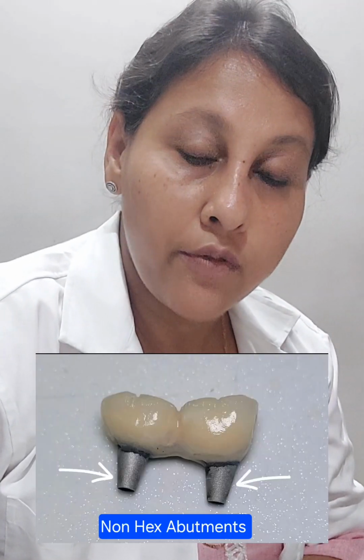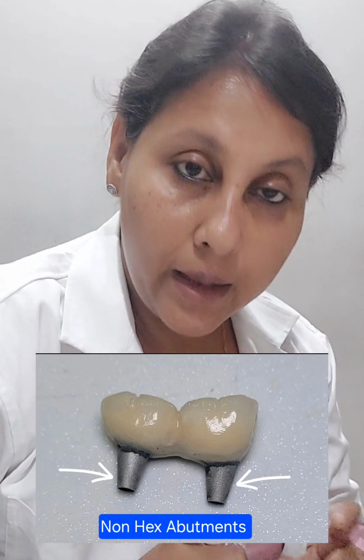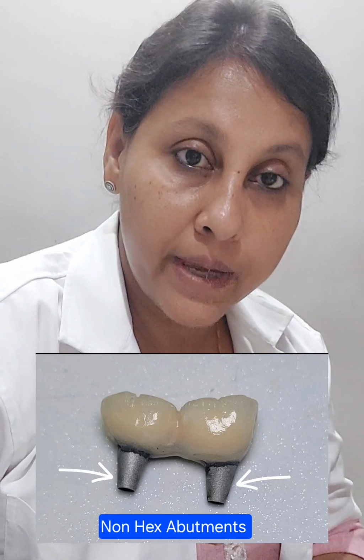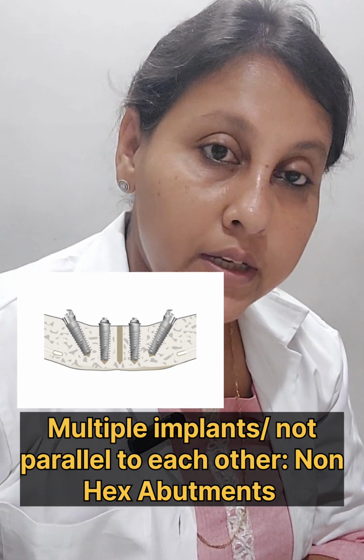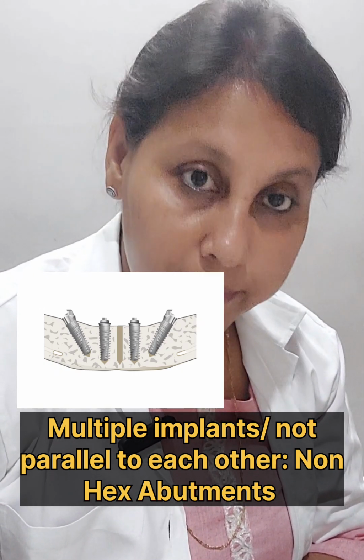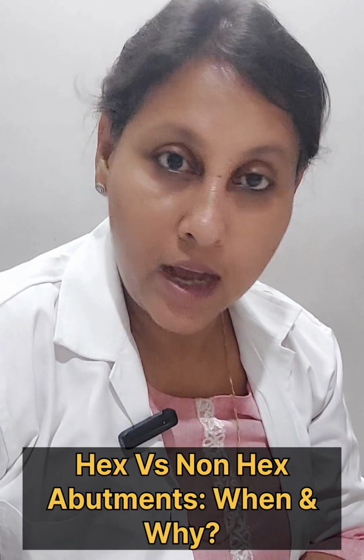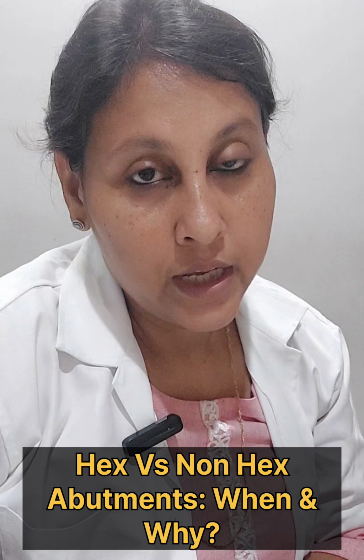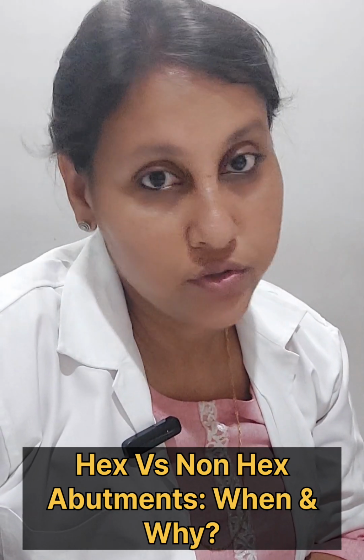Whereas in the case of a non-hexed abutment, the abutment and the prosthesis are made outside, which is then screwed onto the implants. And in cases of multiple implants, we need to use non-hexed or non-engaging abutments. Hope this video will help to clear the doubt about hexed and non-hexed abutments and when and where we should use them.